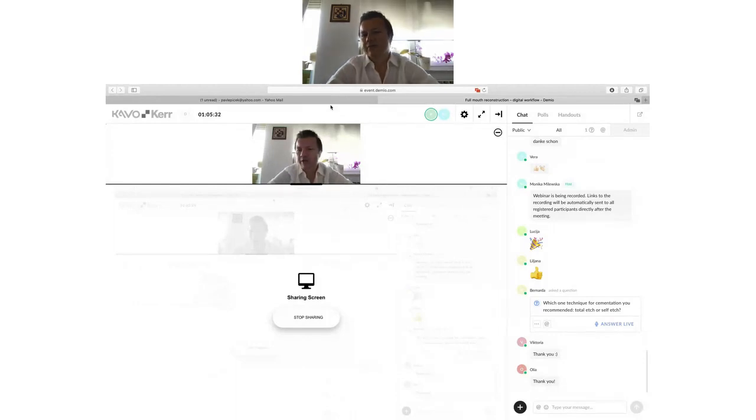I use mostly total etch because I avoid the unnecessary step of using primer and adhesive. So generally, I prefer the total etch technique because I'm quicker. That's the reason. In my office, when we do the cementation, there are 3 or 4 of us, because I'm placing.